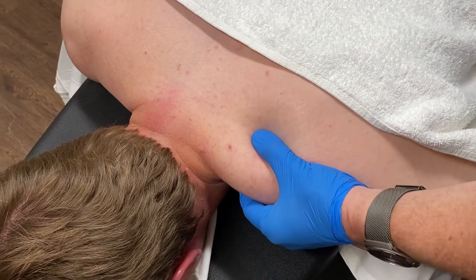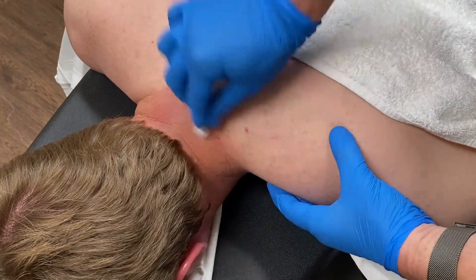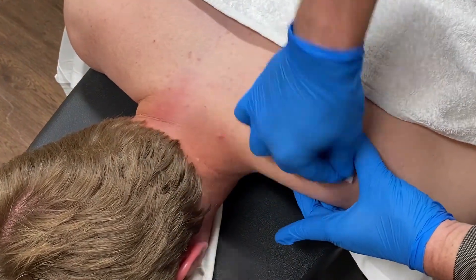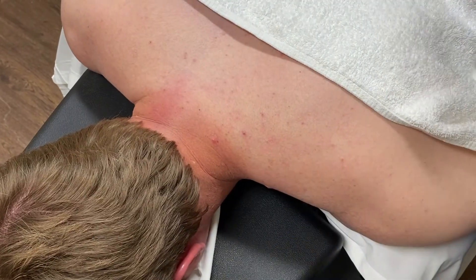Identify the area of the upper trap to be treated. Maintain a clean technique by using gloves and performing an alcohol wipe down.